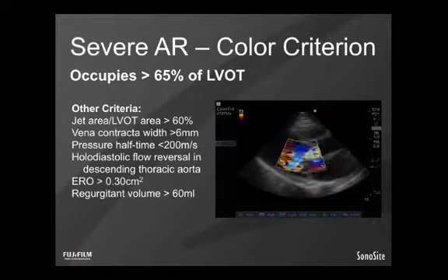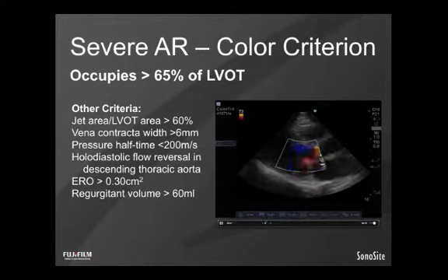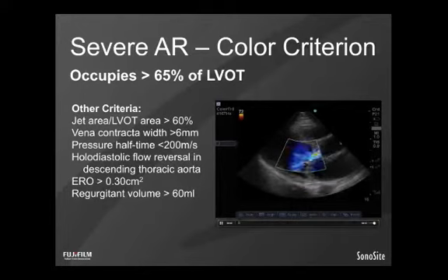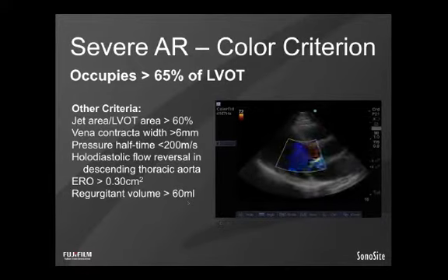So we can see here, again, a non-parallel example of aortic regurgitation, and we can see that during diastole, the blue jet, which you're seeing here, is easily occupying well more than 65 and nearly 100% of the LVOT. Similarly, this is subject to loading conditions. So if a patient with moderate aortic regurgitation might go on to meet severe criteria if they develop sudden systemic hypertension, pushing the gradient of regurgitation more in favor of more backflow.